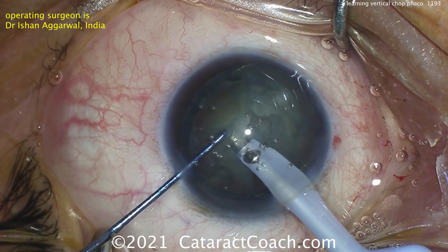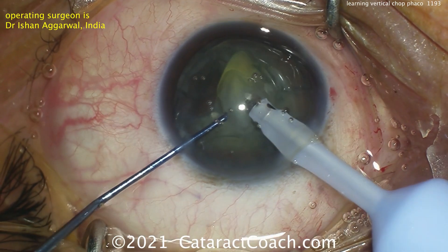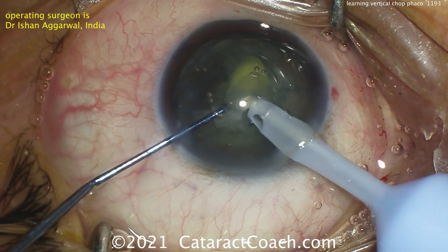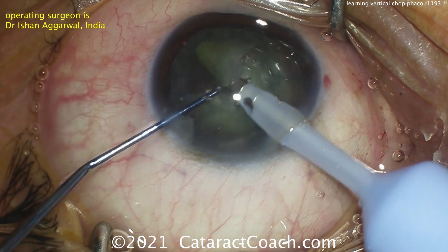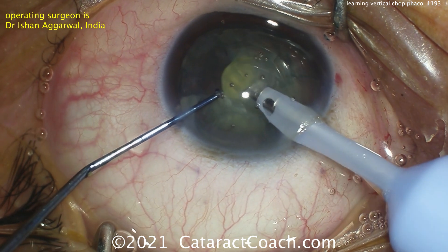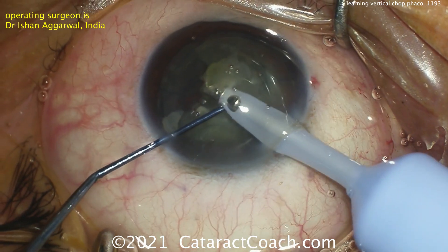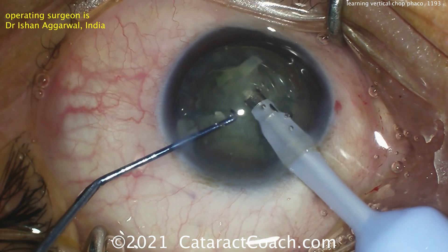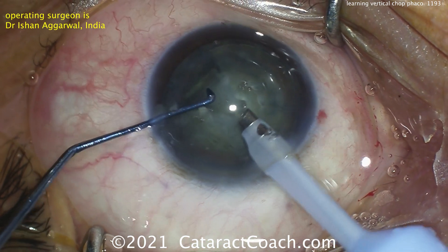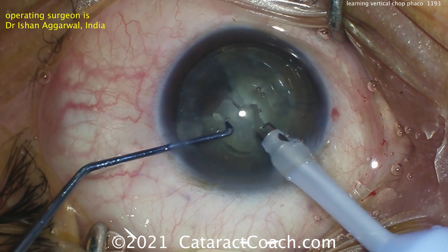Nice job there. And it can be done again, with a small piece broken off. This is the vertical chop technique. Dr. Agarwal here is doing a great job and has reported doing about 700 cases. So this is about 700 cases in, and very good technique for that level of experience. Removing that first quarter can give you a little bit more working room, and then we can get the other pieces, sub-chopping them.